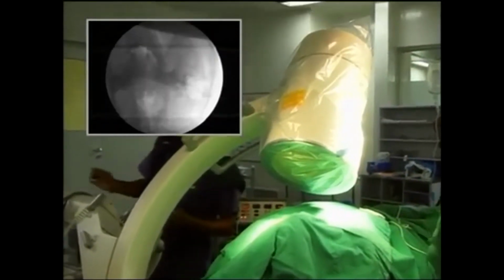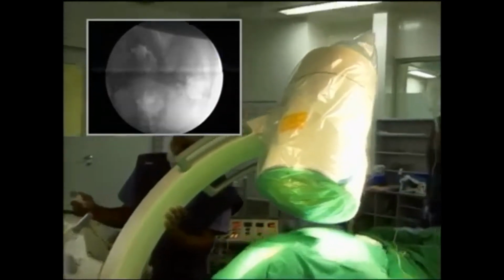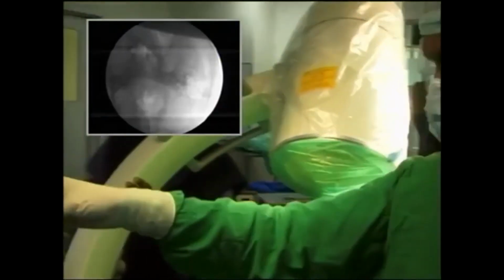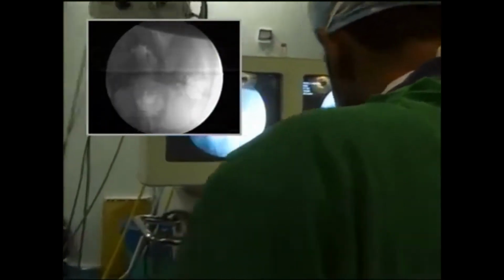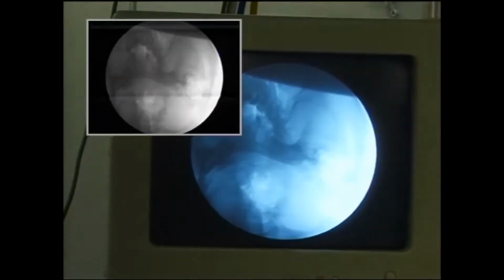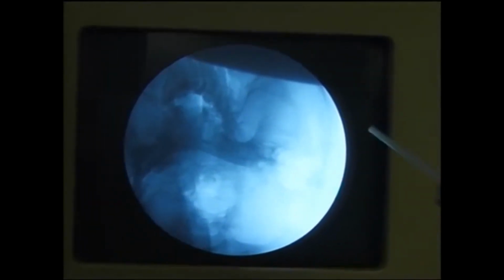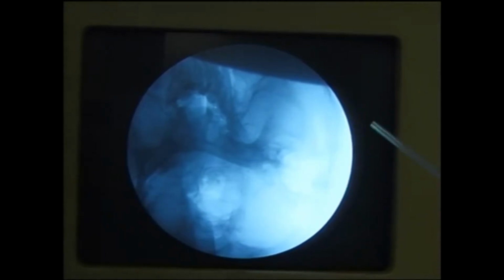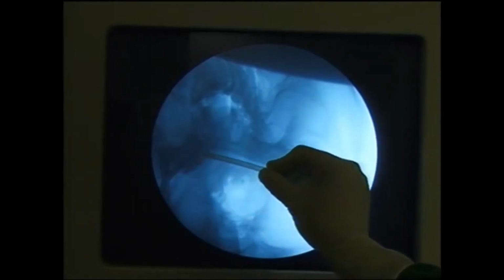Okay, I'm going to come there and explain this fluoro image. Can you focus on this and my marker? Can you see the image where Karthik is focusing? Yes, now it's visible. This is a submental view focused on the left-sided foramen ovale.